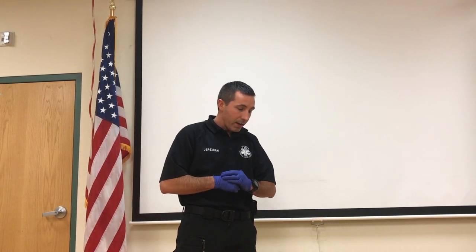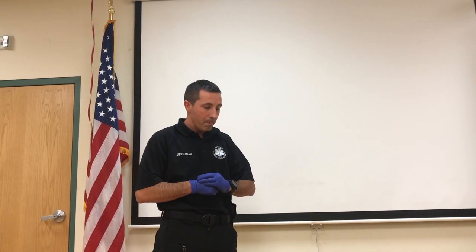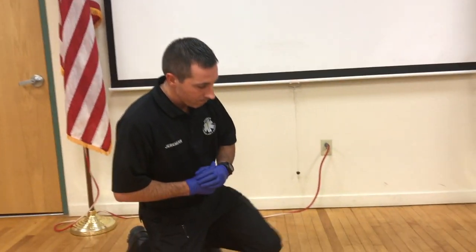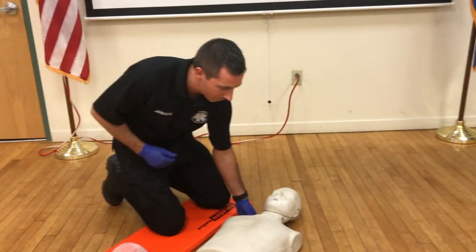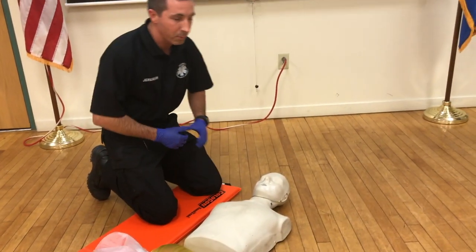I'm going to come in and assess for responsiveness. Is my patient alert? Nope. I'm going to check for verbal stimulus — Sir, can you hear me? No response. Painful stimuli, I'm going to grab the trap. No response. So this patient is unresponsive.